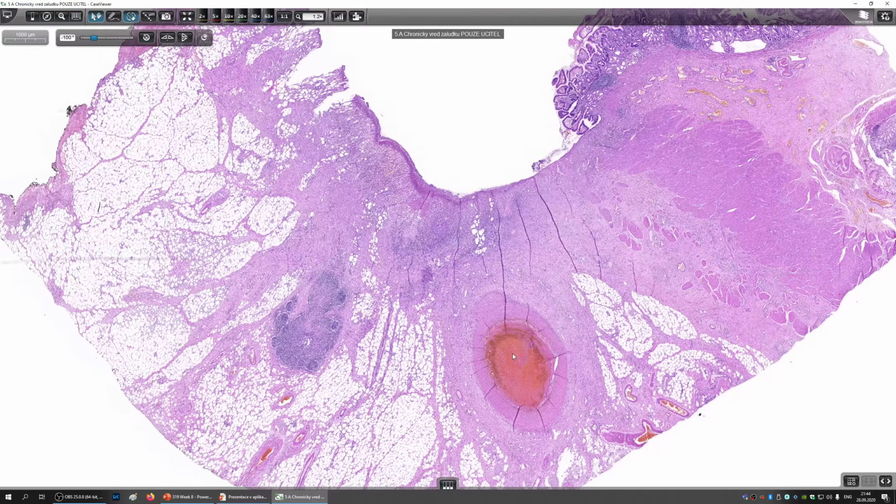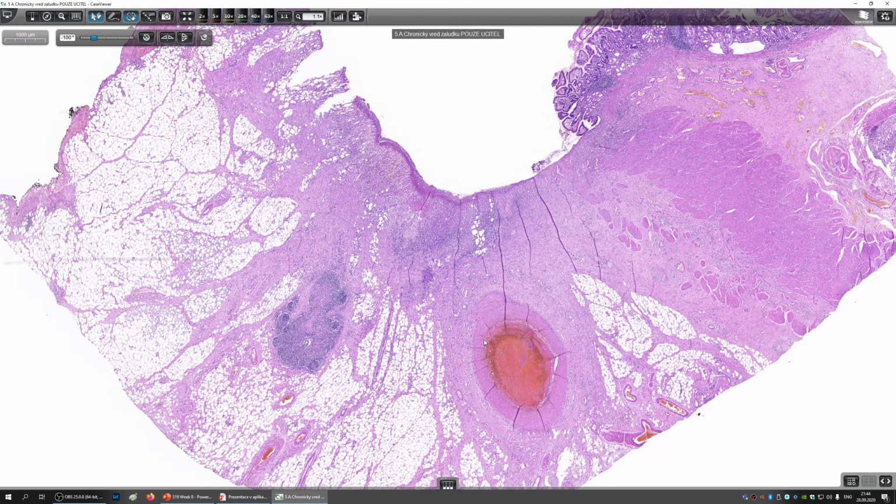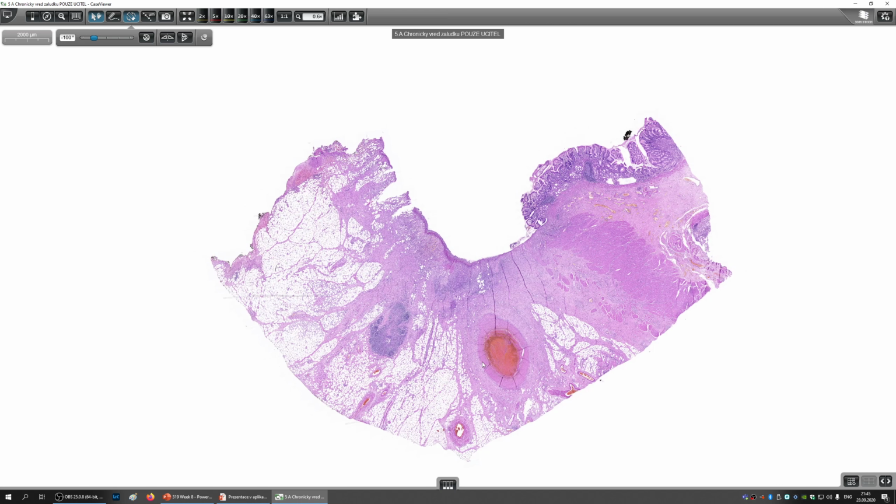So this patient presented with acute symptoms endangering this patient's life. So this patient was operated and they performed acute life-saving, like emergency resection of the pylorus of the stomach, because the ulcer was so big and the bleeding was uncontrollable by endoscopic means.